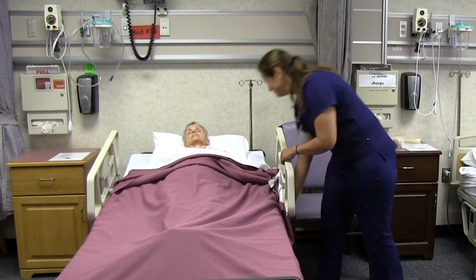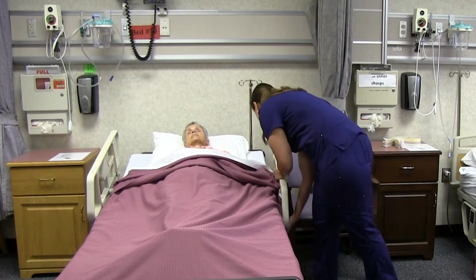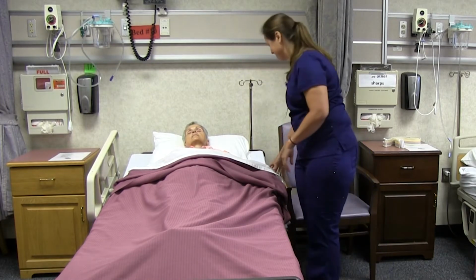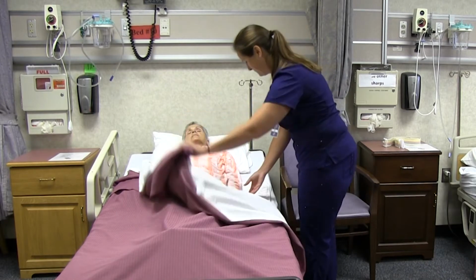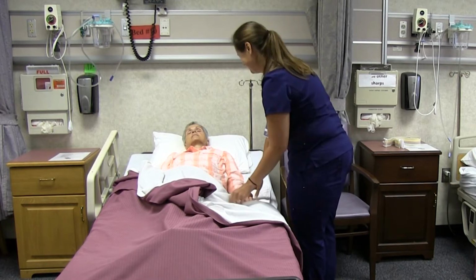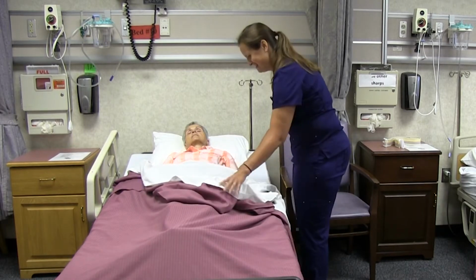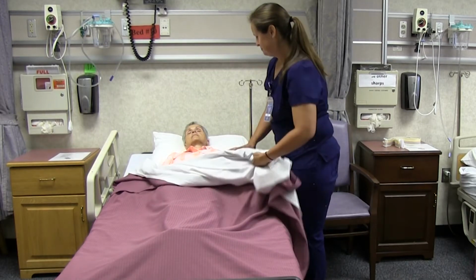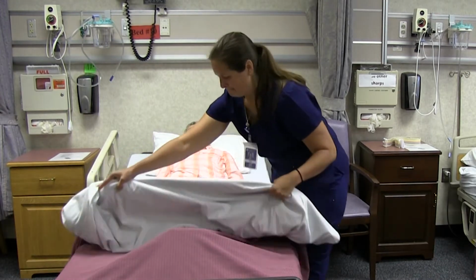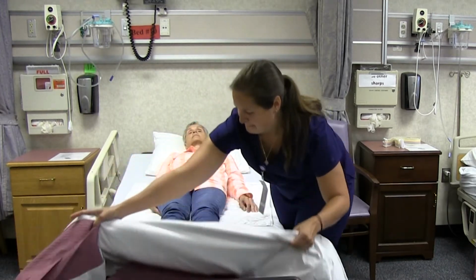We're going to be demonstrating transfer techniques using a gait belt with a partial weight bearing client. The first step is to identify the client with the ID band using two identifiers. Assess physiological capacity to transfer, activity tolerance, ability for balance, cognitive status, and risk for falling. Use an algorithm to guide decisions about safe patient handling.